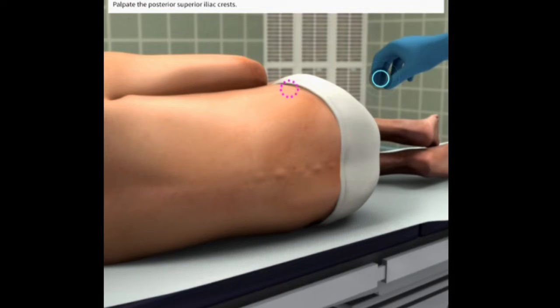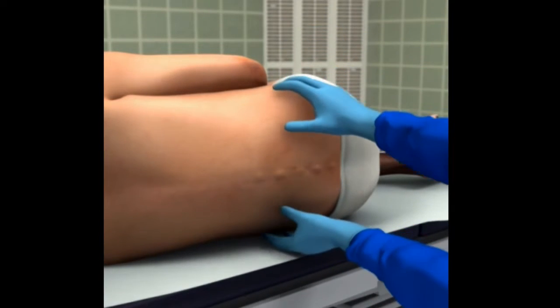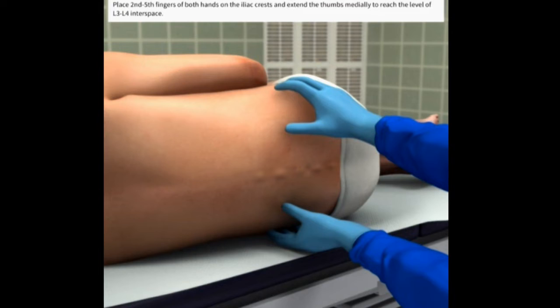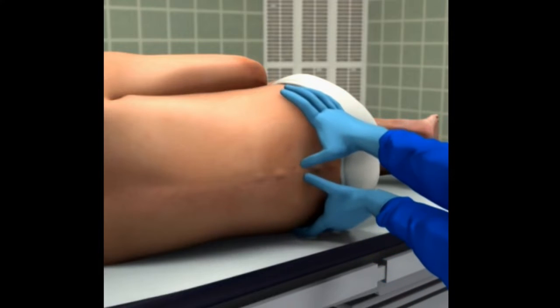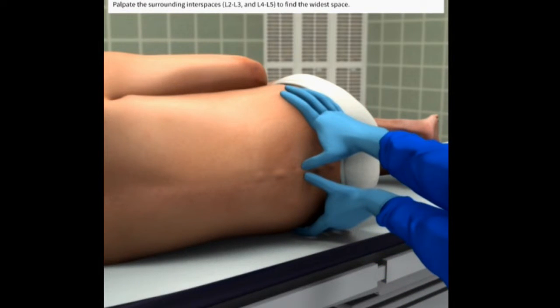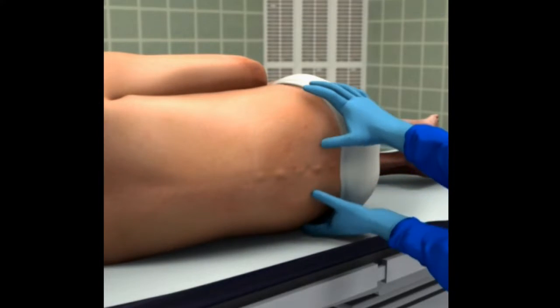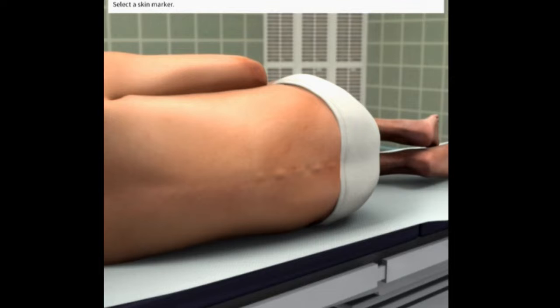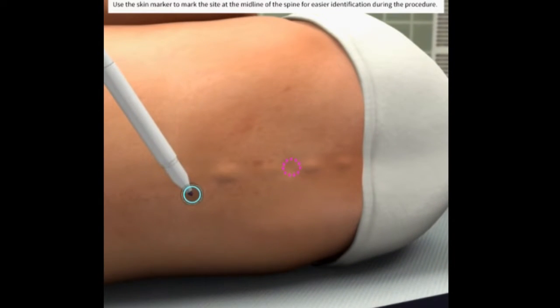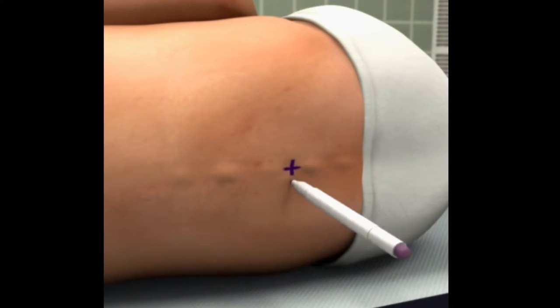Key Anatomy. The iliac crest is identified and palpated with the physician's hand. The physician's thumbs are then placed medially to palpate and identify the spinous processes in the midline of the back. The interspace where the thumbs fall approximates the L4-L5 interspace and is the appropriate location to perform a lumbar puncture. In adults, the L3-L4 space can also be used as it lies below the spinal cord.